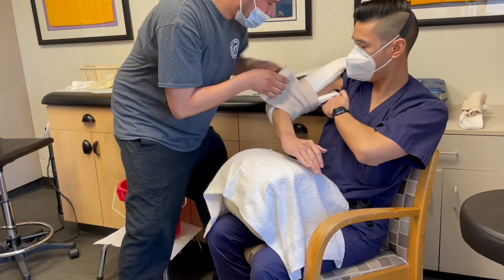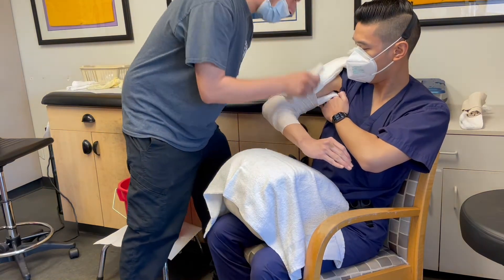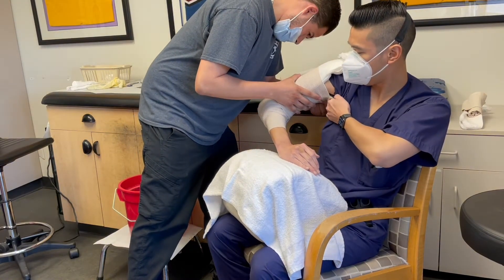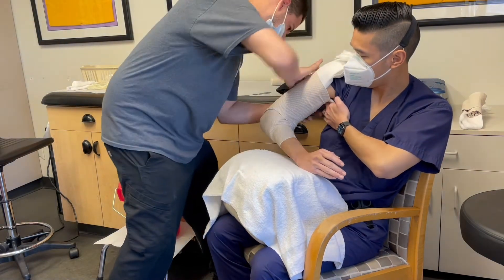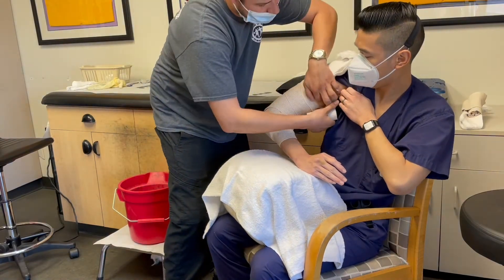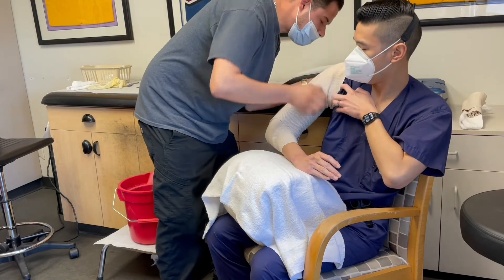Start wrapping proximally to the elbow joint, then catch the elbow, then start wrapping distally, then wrap back up proximally again. You want to wrap the splint snugly but not too tight. Continue to wrap as high as you can.